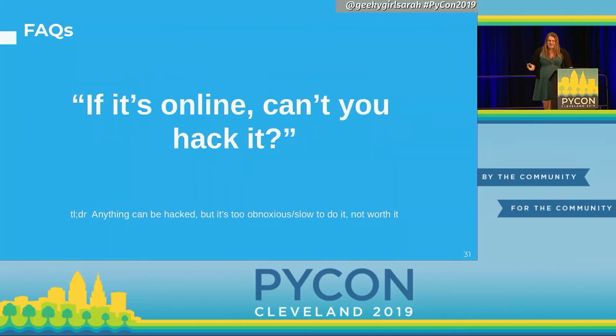Okay, and again, if it's online, can't you hack it? I'm like, sure, anything online can be hackable. But let me tell you how you would actually have to hack this. First you would have to find the IP address of my phone. Second, you'd have to find the IP address of the device that's tethered to my phone. Then you actually have to log on to the device through Linux. And then you have to find the script that actually issues the commands to my pump. Wait several minutes for that communication process to happen.